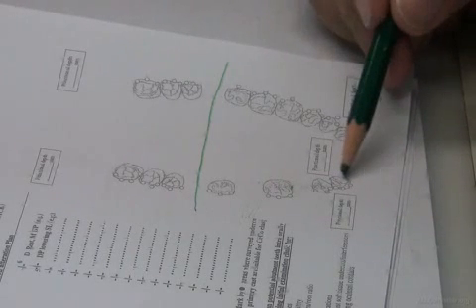Bar. How are you going to connect a bar to this area? It becomes a plate. Whenever we have an anterior bounded saddle area, it becomes a plate. It's no longer a bar.